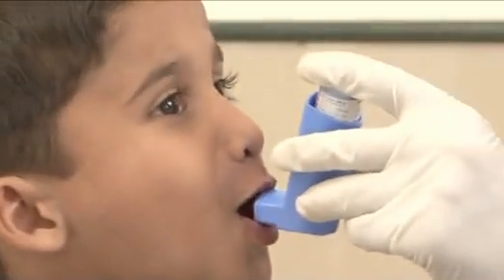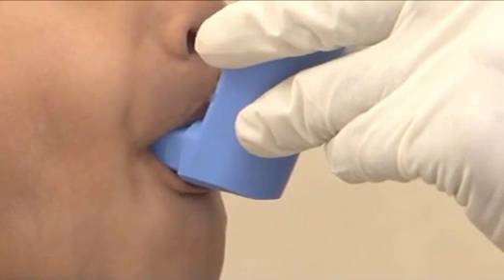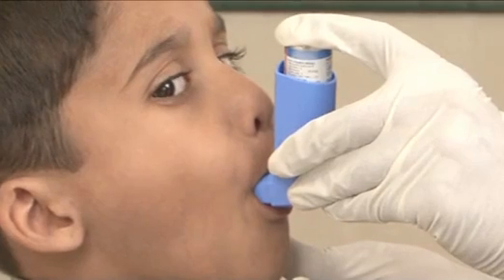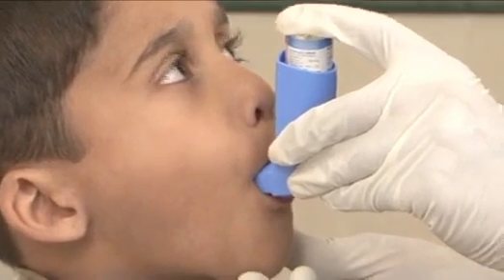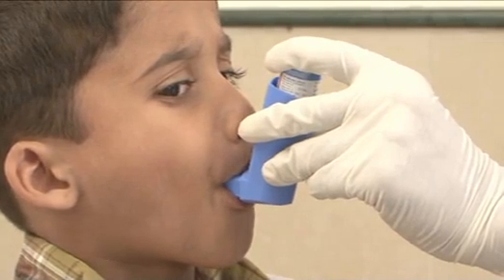Ask the child to place the mouthpiece inside the mouth with lips forming a seal. Instruct the child or mother to press the inhaler and continue to breathe normally. Instruct the child to keep mouth closed for 10 seconds and breathe through the nose.